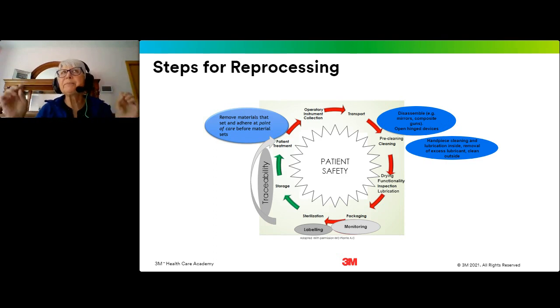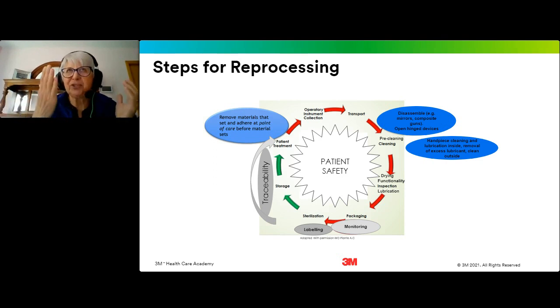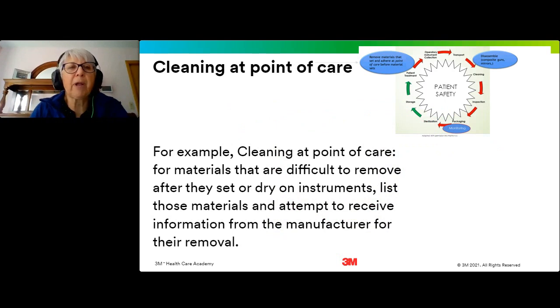When I still hear people use the word disinfect, or confusing the terms disinfection and sterilization, or using the term sterilization for reprocessing, I want to whip out something, maybe a picture or something on my phone. I probably wouldn't be able to do that. But to be able to show all the steps for reprocessing, all the way from the chair where you're actually cleaning off, removing your materials at point of care, and all the way through to use of those sterile instruments again for aseptic presentation. So the entire loop, I call it, or circle or cycle. Really important to think about each one of those steps when you're developing your standard operating procedures.